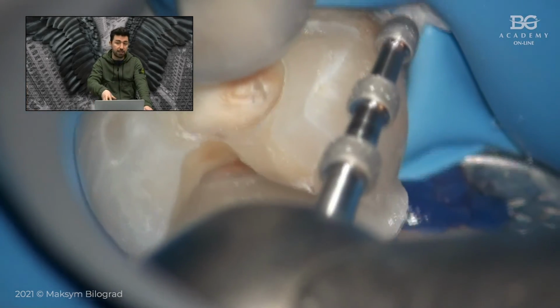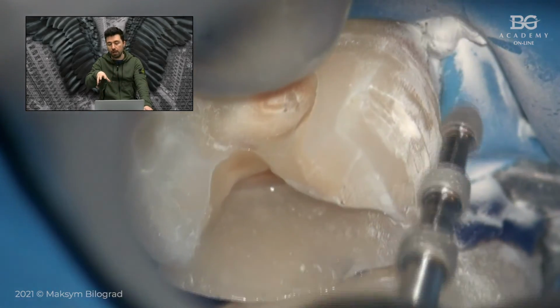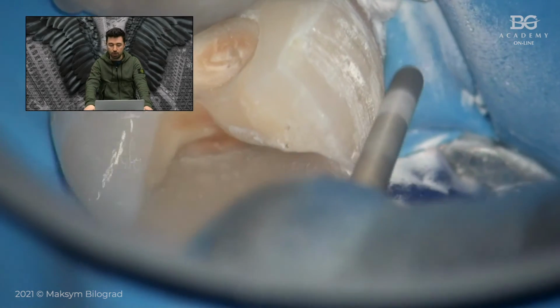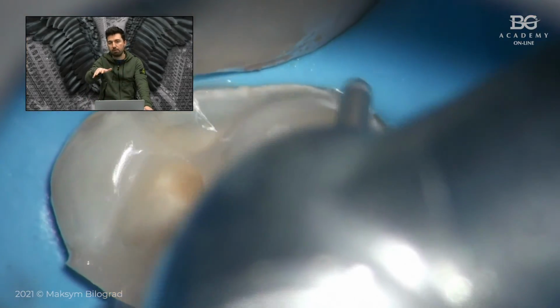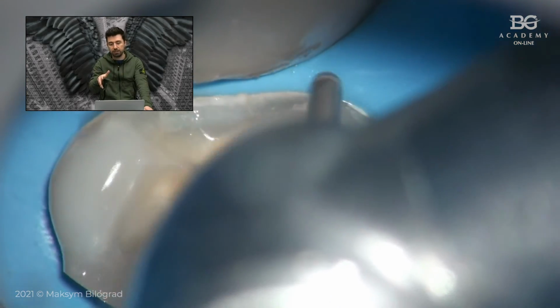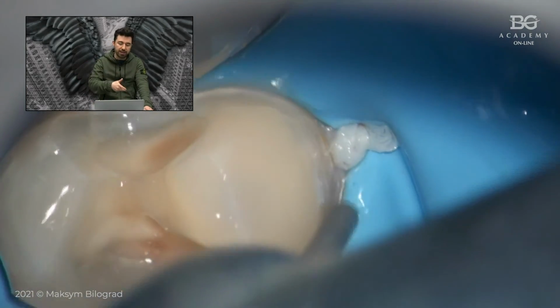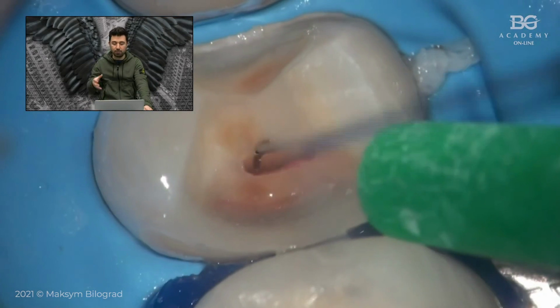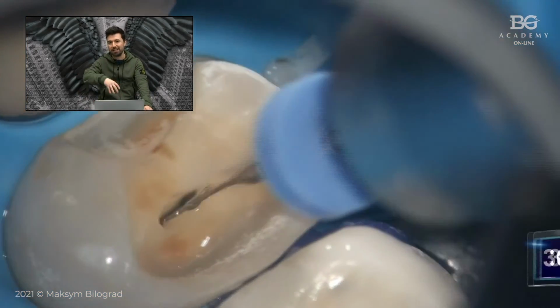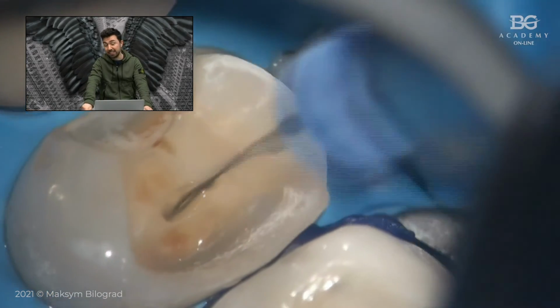We made irrigation, and every time we made irrigation, we continued our preparation for the overlay. So how does it work? We irrigate, then we prep for 30 seconds, then we irrigate again, then we prep for 30 seconds to 1 minute, then we irrigate again, and then we prep for 1 minute or 30 seconds. So basically we irrigate and prep, irrigate and prep, irrigate and prep. And actually this is the way we can save a lot of time.